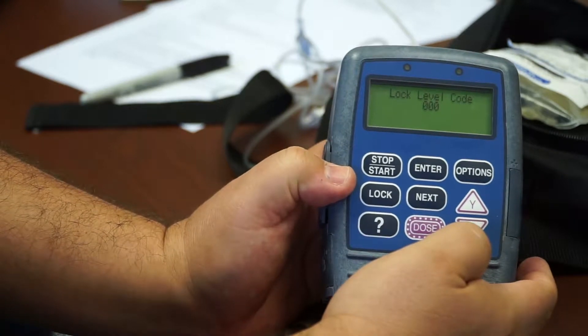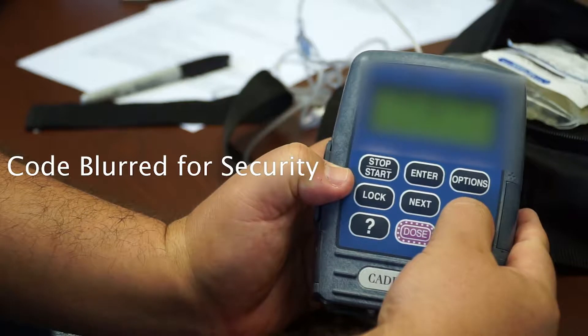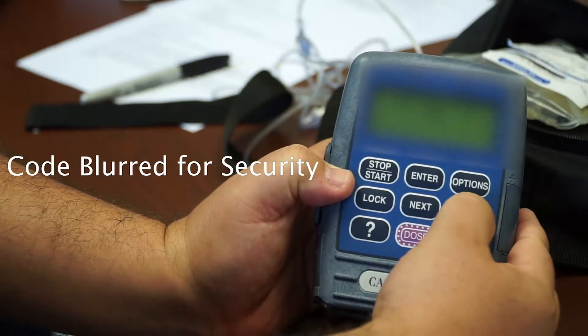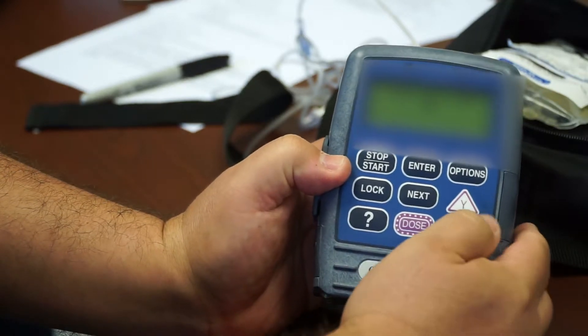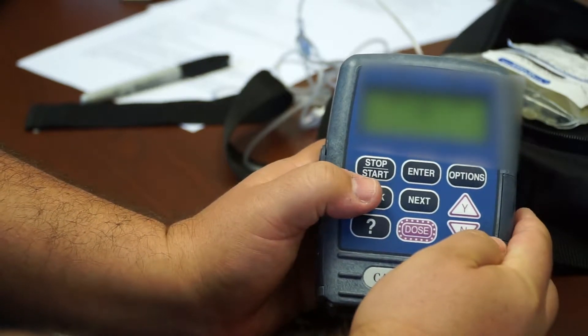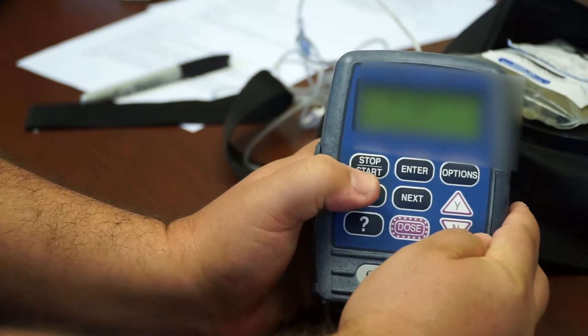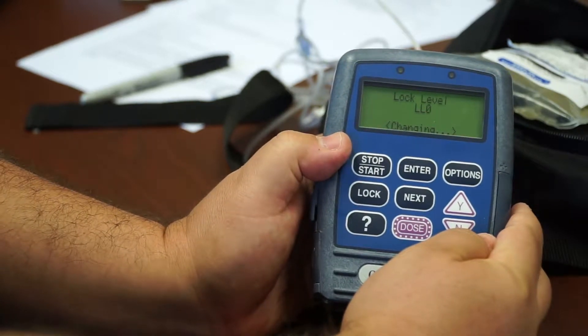And then it'll ask you to enter a code. You put in the code, you click on lock again, and it'll say lock level changing.